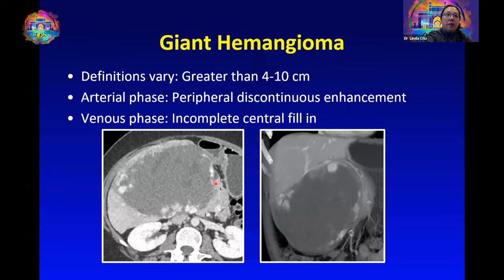Similar to a classic hemangioma, on the arterial phase we expect to see peripheral discontinuous enhancement, and because of the sheer size of the lesions on the venous phase we expect to see incomplete central fill-in.